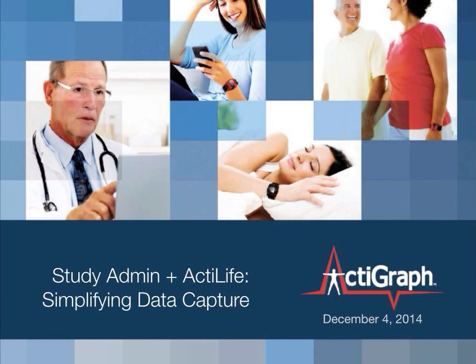My name is Jeremy Wyatt, and I'll be presenting today's webinar, which is entitled Study Admin plus ActiLife: Simplifying Data Capture. We're going to talk a little bit about logistics today and how to properly and efficiently get your data, and talk about some secrets and keys to doing that using some of our new tools that we have made available. And so we'll go ahead and get started.